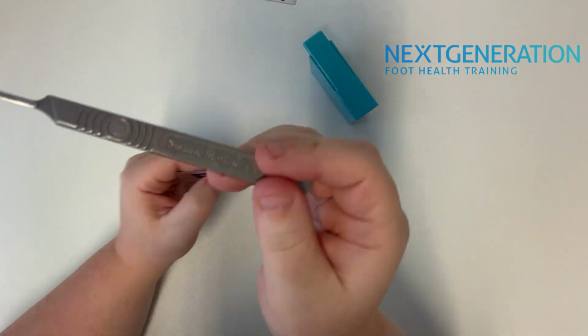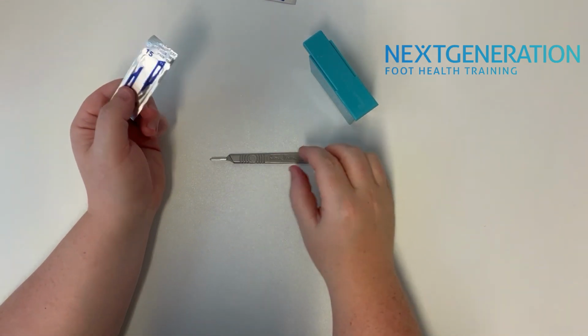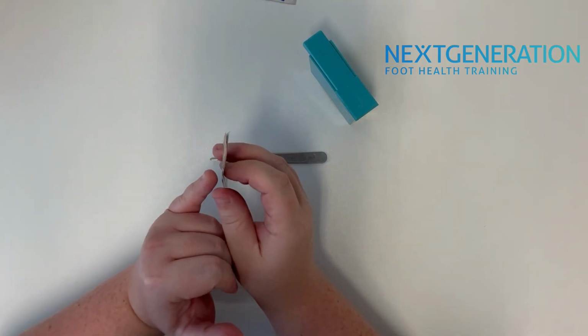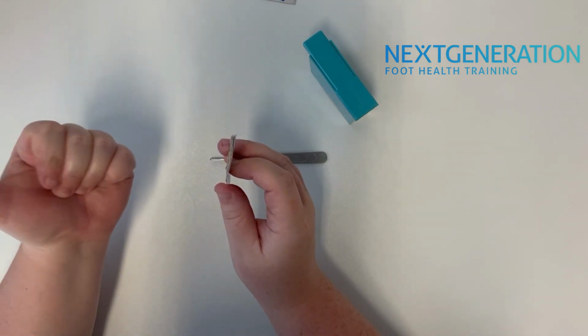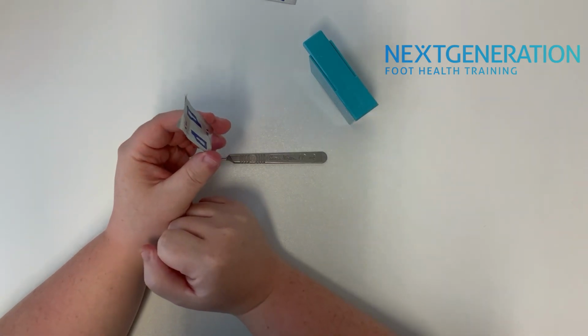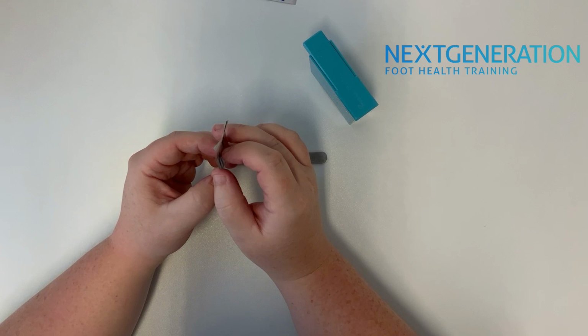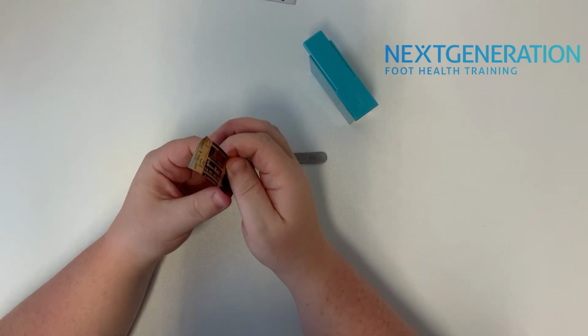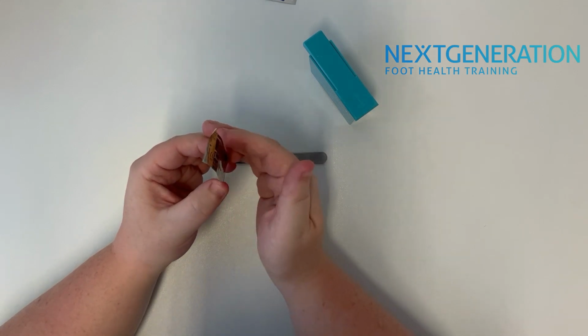So I'm just going to show an example with one blade. So when we open the packet, if we are right-handed, it's better to learn by having the gold side facing to your left and then having the silver side facing to your right. If you come on the course and you're left-handed, we need it the total opposite way around to this.